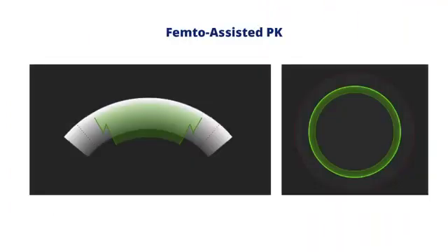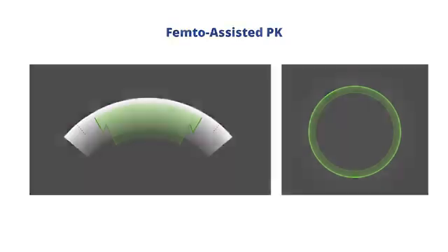There's an enlargement of the profile that I've planned here. You can see this one doesn't go through to the corneal surface. It starts within the anterior stroma, very anterior stroma. It continues on well through the endothelial segment, which may look a little odd, but that's so you get complete clearance and a complete cut. And again, the same on the donor cornea.